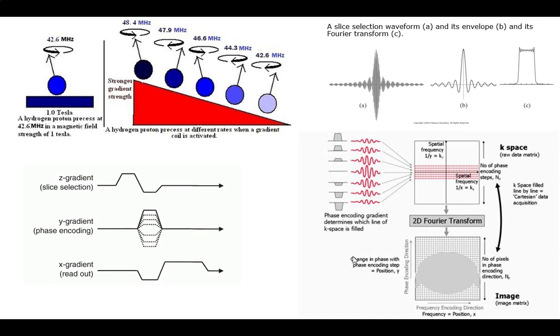People also use wine cups as another classic example. Guitar strings too: you pluck them, you kick them with one thing, but they have an innate resonant frequency. If you were able to pump in a frequency wave that wasn't in tune with the resonance frequency of a guitar string, you wouldn't get that nice note. It would cancel out. Your highs and your lows would cancel, and it's all done with. Whereas if it's resonant, the high will get another high pulse and go higher. So that's what we're doing on the first part.